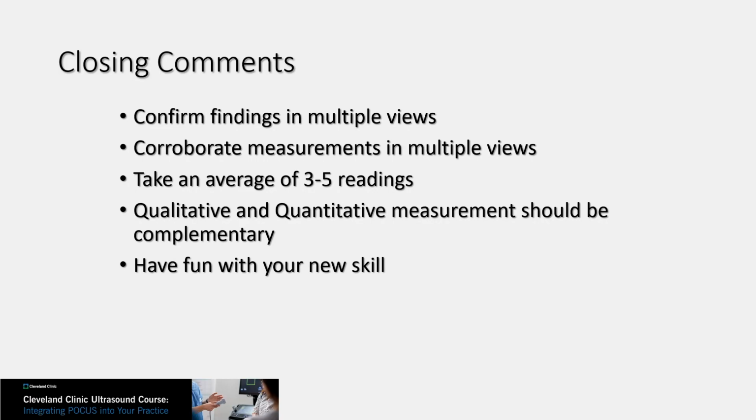The qualitative assessment and the quantitative assessment are complementary. If you have a qualitative assessment that is saying something and the quantitative assessment saying something other, try to see why there is that discrepancy, and have fun with your new skills.